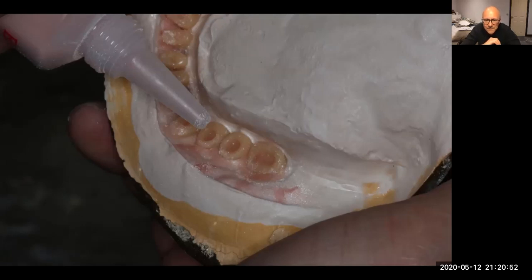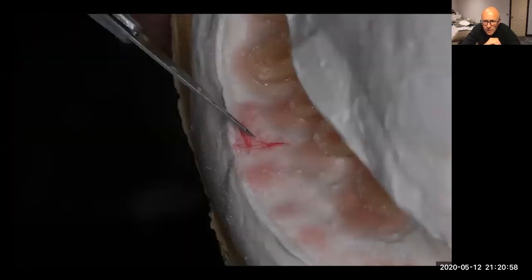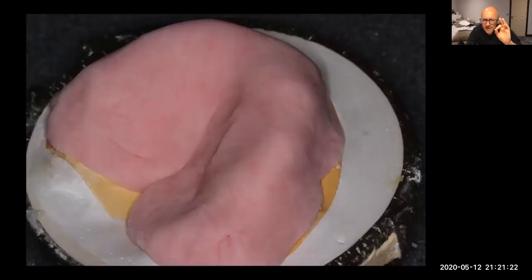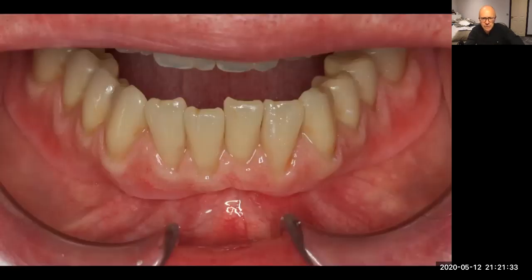So he pops that in and layers that up with all different colours. And then the finishing touch, and this is dead important, is these veining fibres. These are Candulor veining fibres that are just placed in the buccal sulcus area, so this is the non-attached gingivae. Dead important, those little fibres. Beautiful. It's fantastic. And then Rowan mixes up the dough, packs it, double packs, and then finishes it, cures it, and then the dentures look superb.